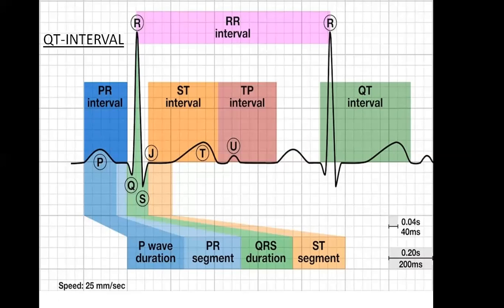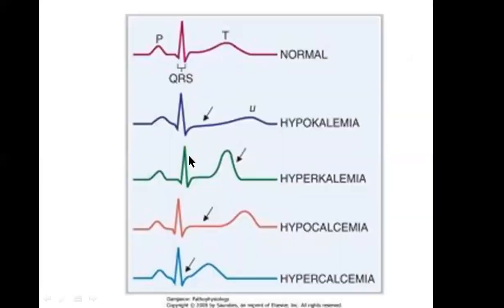So friends, here you can see a normal QT interval, and over here is a prolonged QT interval.